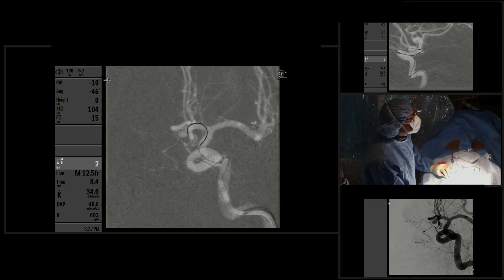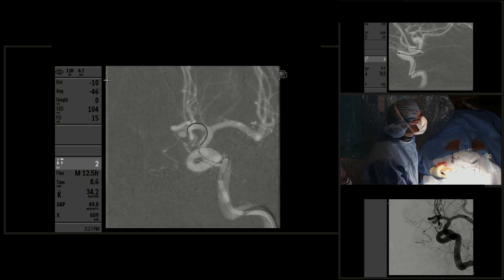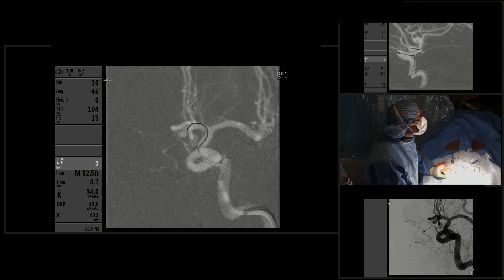This patient has an isolated hemisphere with bilateral A2s coming off the left ACA. You can see how carefully we are advancing a Prowler 10 microcatheter over a Silverspeed 10 microwire into the aneurysm. We're doing this very slowly to prevent perforation of the aneurysm.